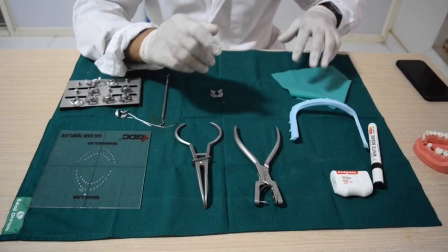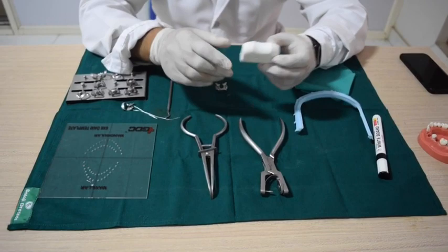Apart from that, we would require dental floss for securing the clamp and for passing the floss between the interdental contact.